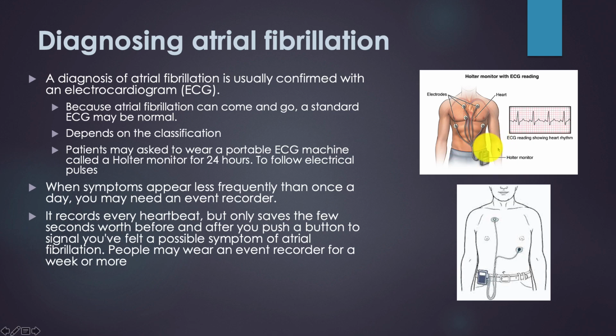And these are called Holter monitors. They also have something called portable event monitors, and they essentially do the same thing. They're just these small external recorders that are worn over a short period of time. Some can be 1 to 3 days, some can be 5 days.